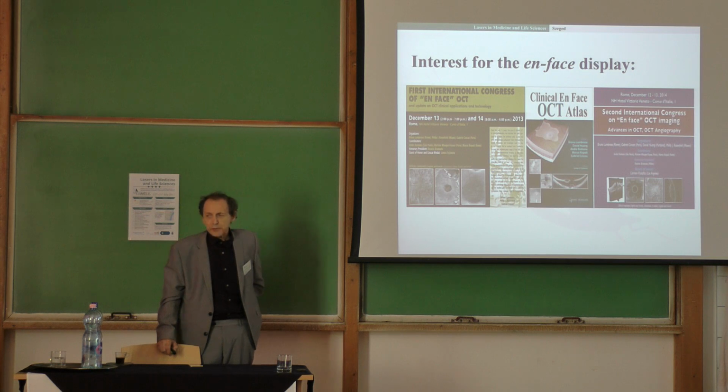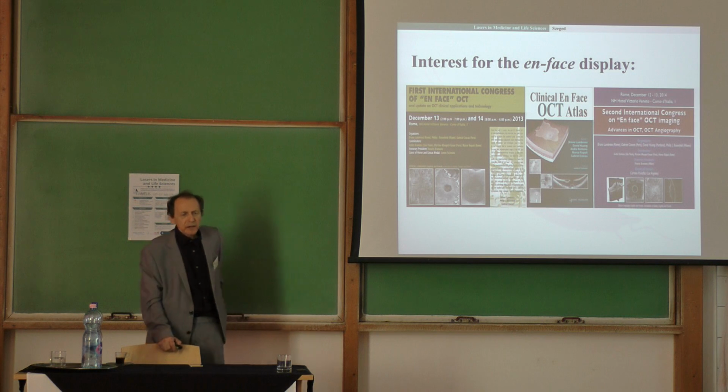One is ICG, green, and the other one fluorescent. So they are injected, and you use fluorescence of that emitted wavelength. The drug is emitting fluorescence. You look at fluorescence and you see the vessels. But that is, let's say, invasive because you have to inject the dye.